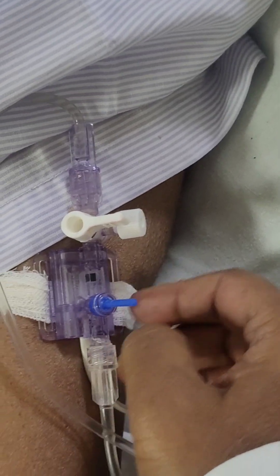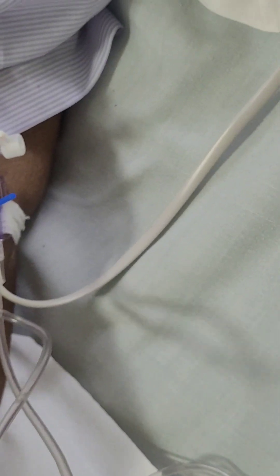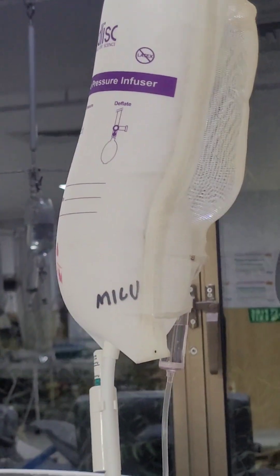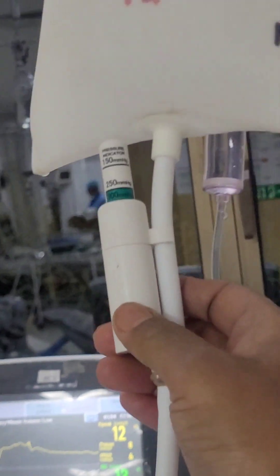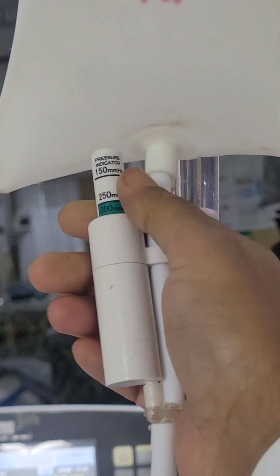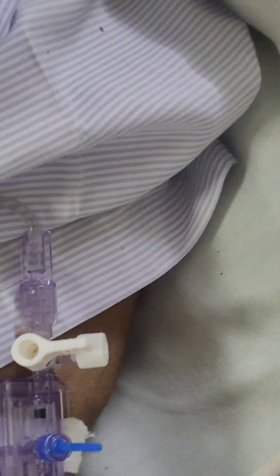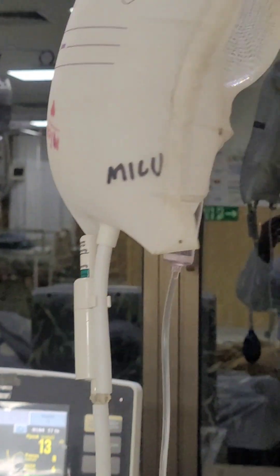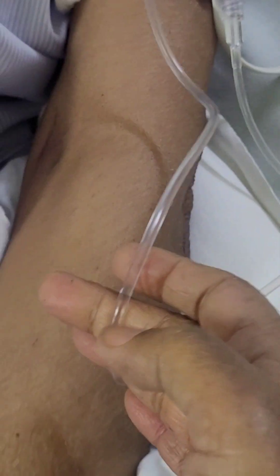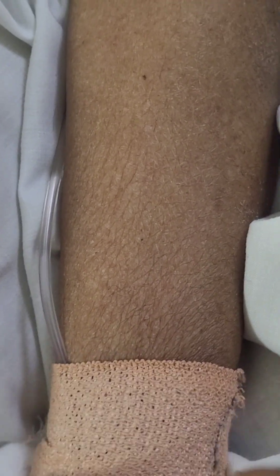Any transducer will have one end — the down end — which goes to the presser bag. This is the presser bag; if there is an arterial transducer attached to the arterial line, you have to keep the pressure bag at 300. This down end goes to the pressure transducer center, and the upper end goes to the patient's arterial line.